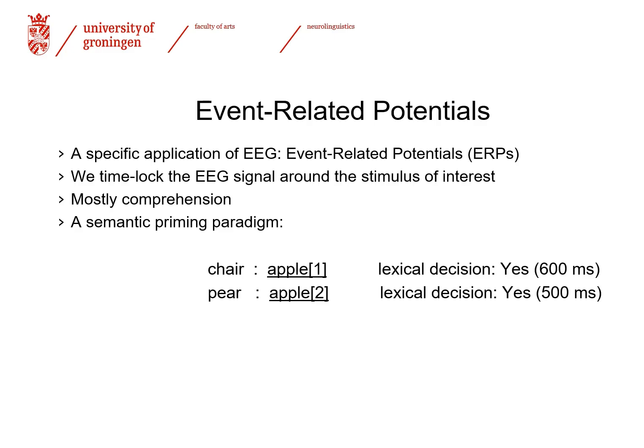As I may have mentioned, the definition of EEG is that it is a continuous recording, meaning that if you go for a clinical EEG, your doctor is going to observe you and have your EEG recorded for maybe 20 minutes, or 8 hours if you go for a sleep study. And this is going to result in one huge recording that is then probably going to be eyeballed. It really depends.